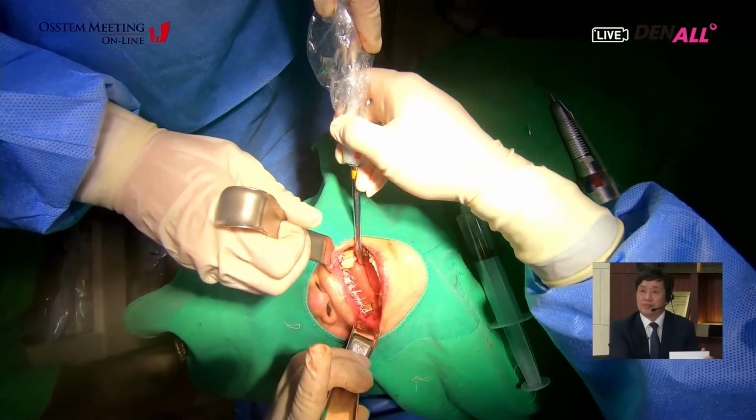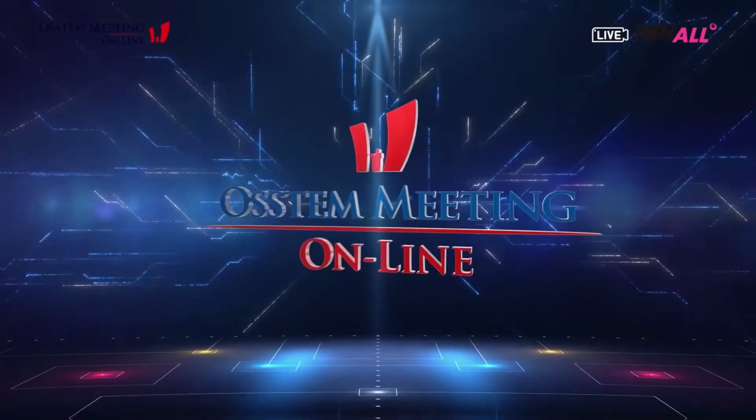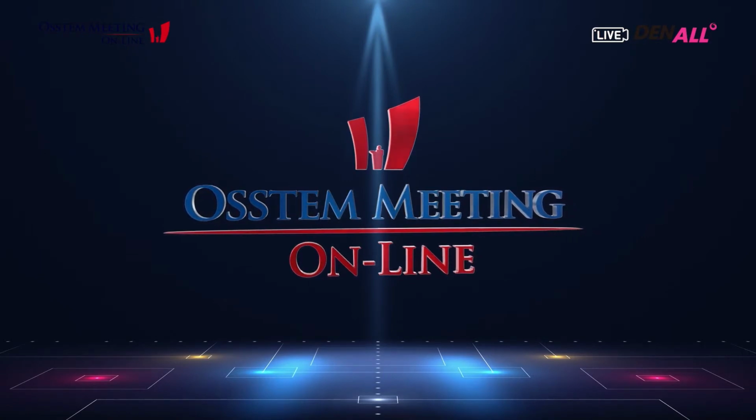Yeah, and then I will take a panorama and the CBCT, and then let's have a Q&A session. I think that Dr. Kim's lecture and his live surgery is very wonderful and outstanding. And I think that the viewers should give him a big hand. Thank you. So let's take some time for live Q&A sessions.